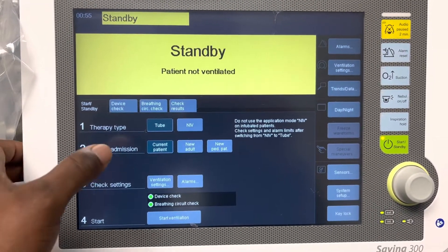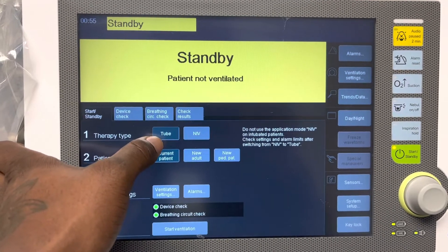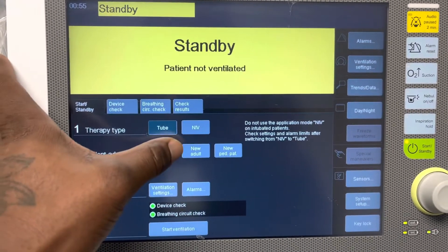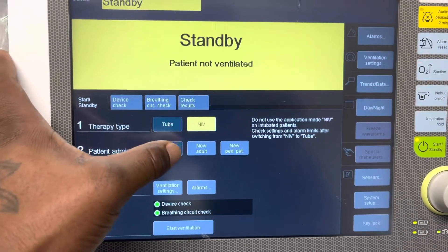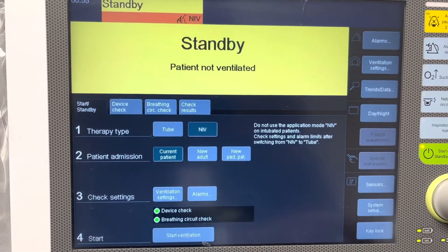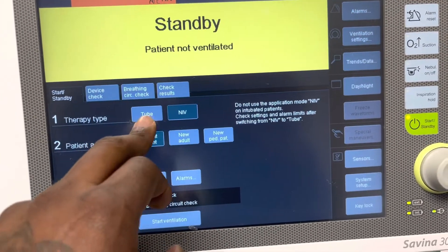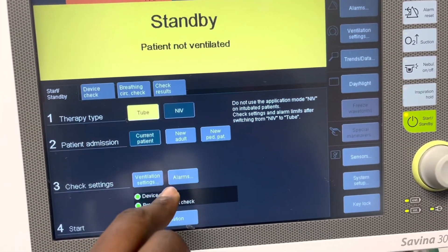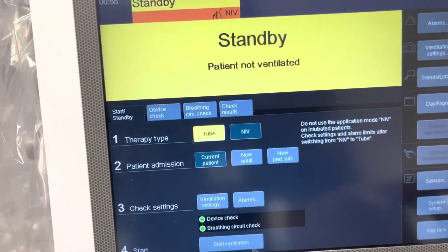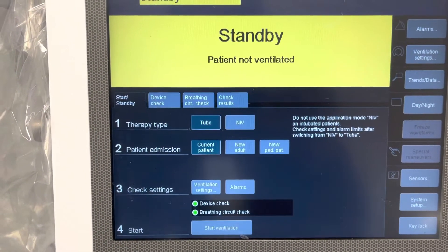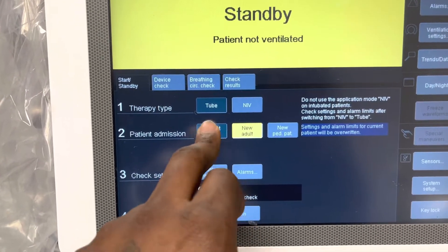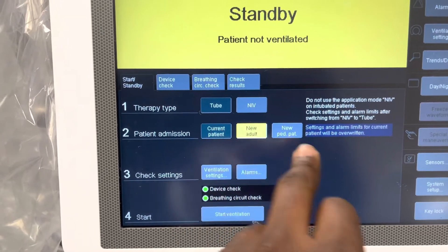It has the settings for patients just intubated — the trache or endotracheal tube — non-invasive ventilation, BiPAP, and CPAP therapy. You can also put it back to a patient that's tubed. Options include new patient or current patient, so we will set up a new patient.